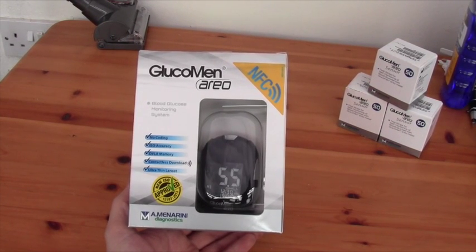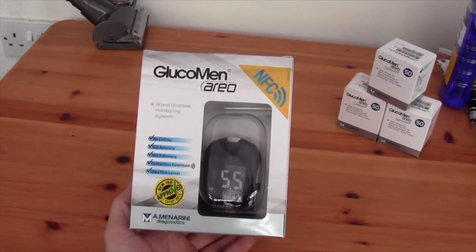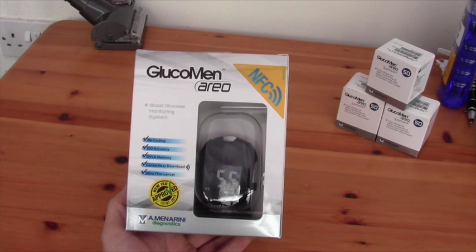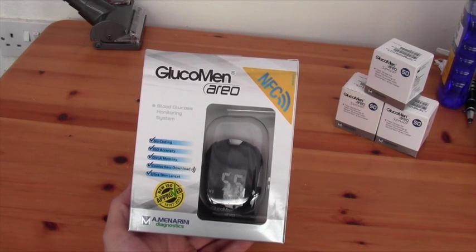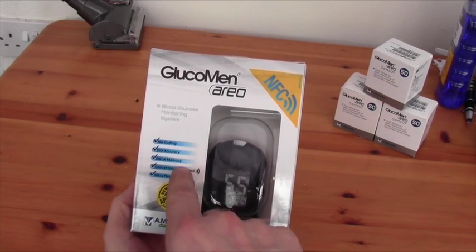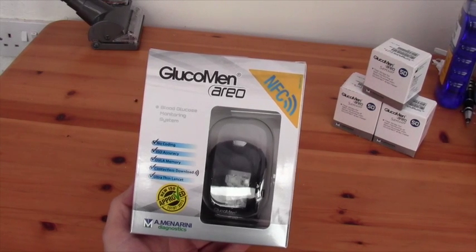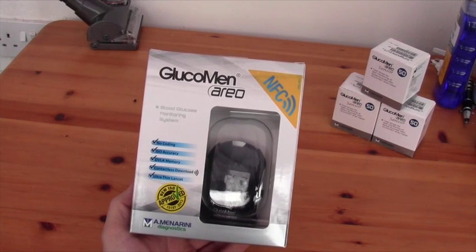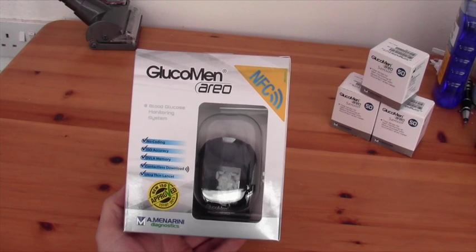What I thought we'd like to take a look at today is the Glucomen areo meter. The thing that most draws me to this meter is the fact that it's NFC compatible, so that you can download your readings to your mobile phone without the need for cables. Obviously that's only working with Android phones at the moment. It is ISO accuracy, which is a standard that has been set for the accuracy of these meters, and most of the main brands now conform to this, giving you a sense of security that your meter should function within acceptable parameters.